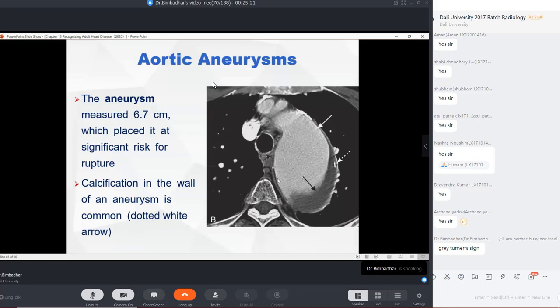And this is not a normal study. This is a contrast study because I can see the blood vessels being completely white. We will talk more about recognition of angiography later on. But how can I recognize it first? Without contrast it has no density, but if a contrast material has been given, the arteries start to appear more white. Okay, this is a contrast study, and this is expansion of the aortic aneurysm.